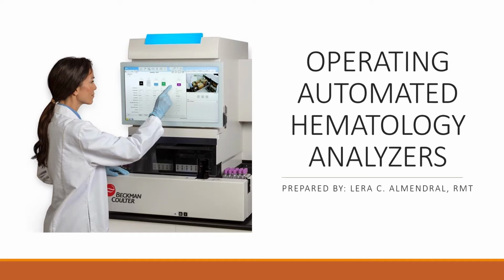Hi everyone! Today we are going to discuss operating automated hematology analyzers and the principles behind them. Automation provides greater accuracy and greater precision as compared to performing manual methods. In the 1980s, instrumentation virtually replaced manual cell counting, and many companies have already marketed multiple instruments that can be used inside the hematology laboratory.